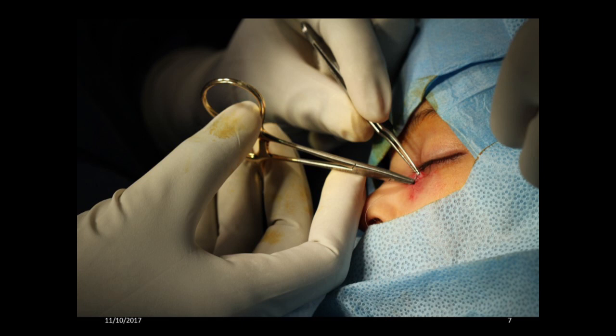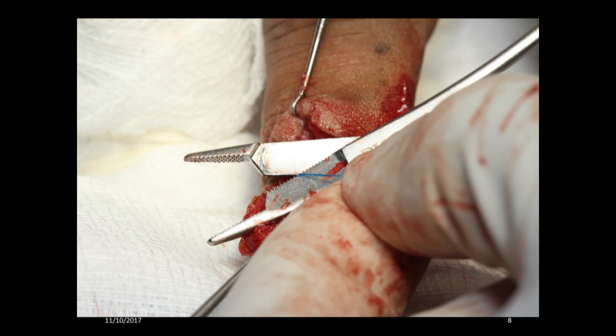This is a close-up view of the type 2 needle holder with the teeth on one of its jaws holding and stabilizing the suture material while the other jaw cuts the suture material. Now let us see some of the videographs in which the needle holders are being used.